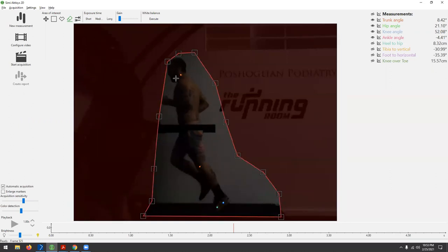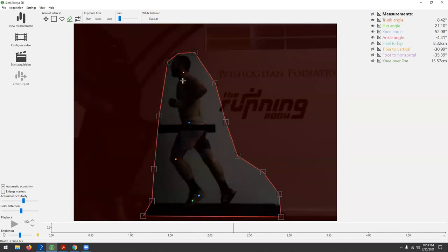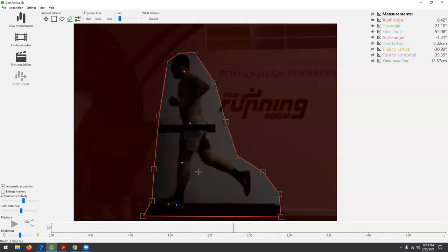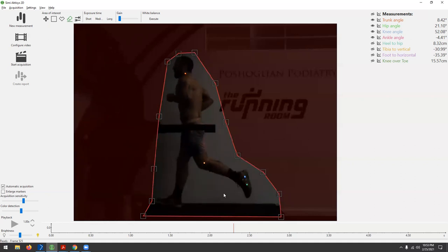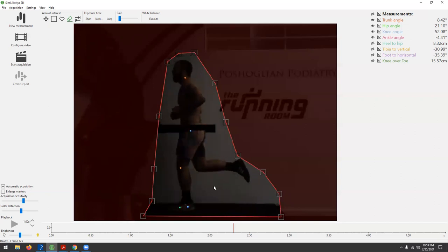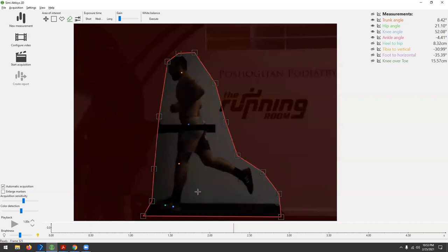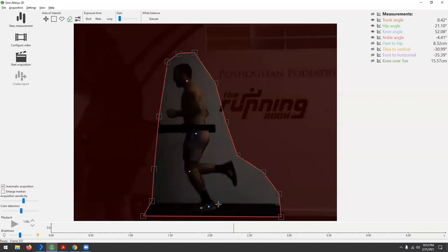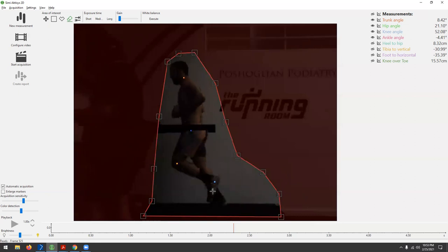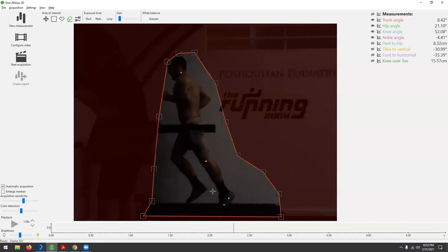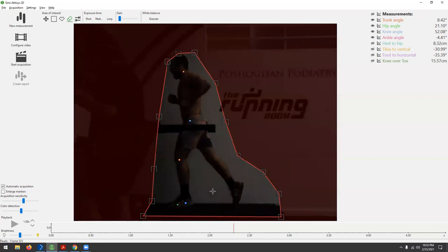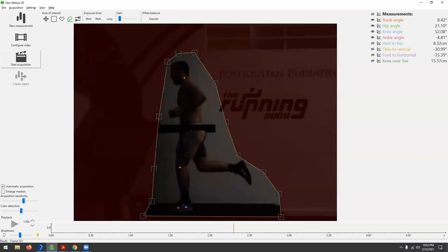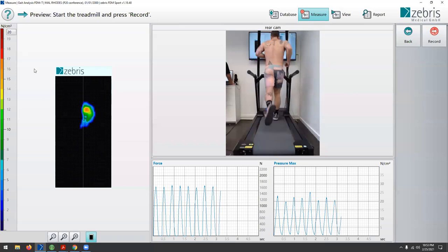This is Simi-Aktysis. We have a high-speed camera with active markers on different bony landmarks: one on the neck in line with the trunk, one on the greater trochanter, one on the lateral joint line, one immediately distal to the lateral malleolus, and one on the fifth metatarsal. Sometimes markers on the shoe need to be placed slightly above the fifth met because the sole stack height may interfere. We're going to get Mel to run and take some data.